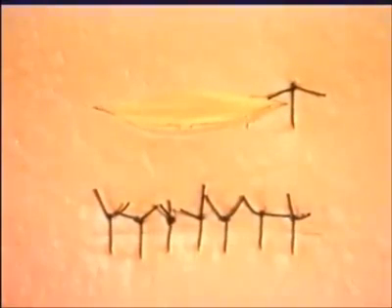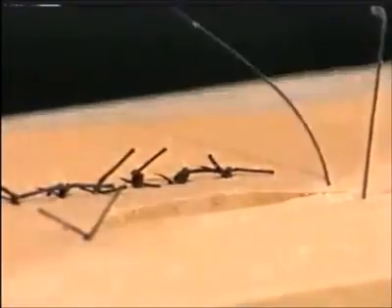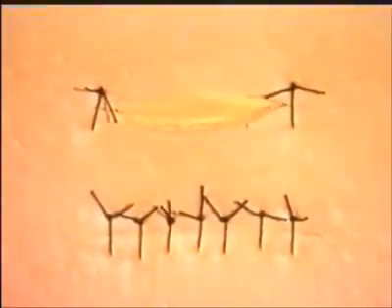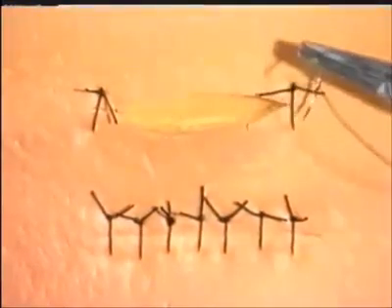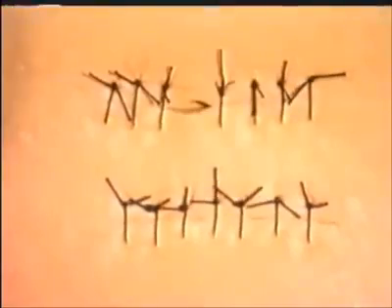You can then proceed to the other end of the incision, and in a similar manner, insert the suture at right angles, into the depth of the wound, and then out again at right angles, onto the other edge of the incision, and tie a standard reef knot. You are now in a position to continue to close this ellipse, working from each end alternately, inserting interrupted sutures like this. This makes for a most satisfactory closure.